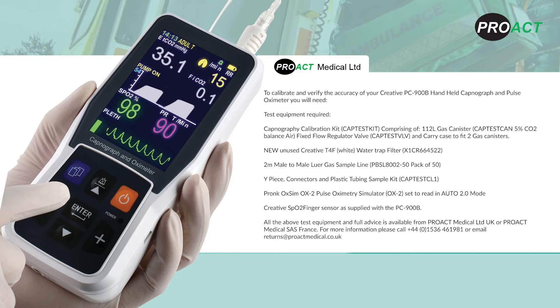You will also need a new unused Creative T4F water trap filter, 2m male-to-male luer lines, Y piece, connectors and plastic tubing sampling kit, a Pronk OxSim pulse oximeter simulator set to read in Auto 2.0 mode, and Creative SpO2 finger sensors as supplied with the PC-900B.